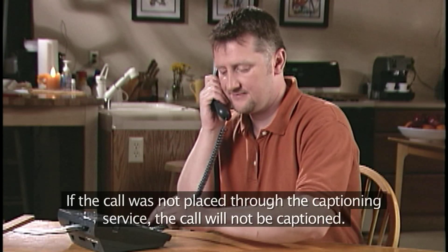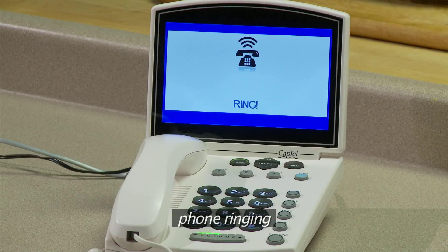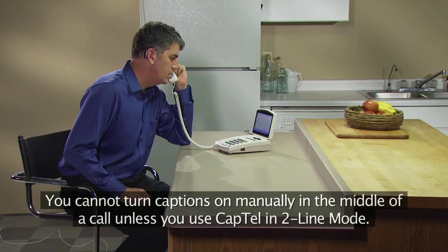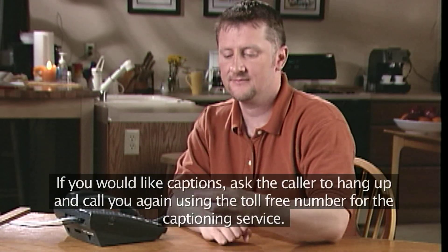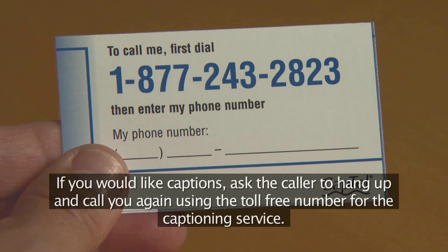If the call was not placed through the captioning service, the call will not be captioned. You cannot turn captions on manually in the middle of a call unless you use CapTel in two-line mode. If you would like captions, ask the caller to hang up and call you again using the toll-free number for the captioning service.